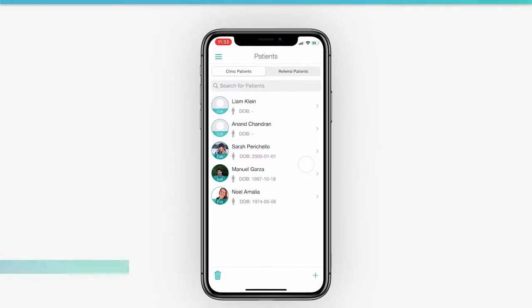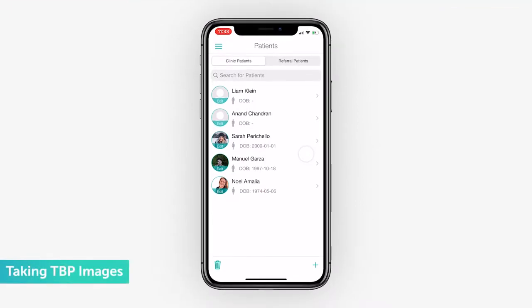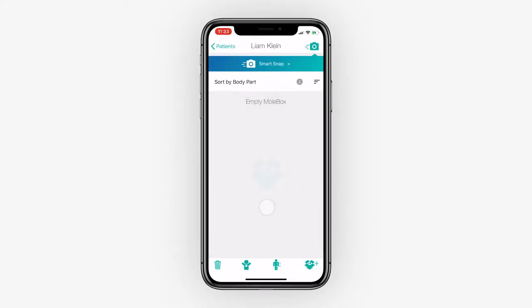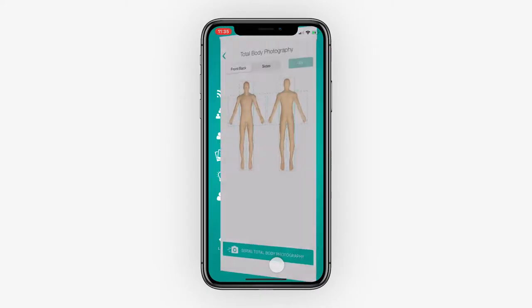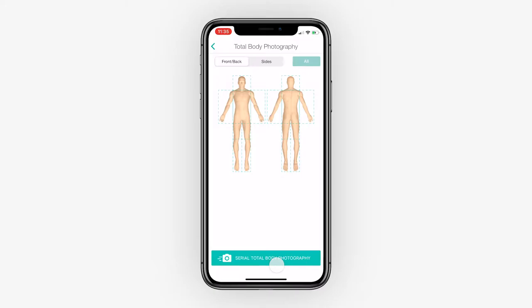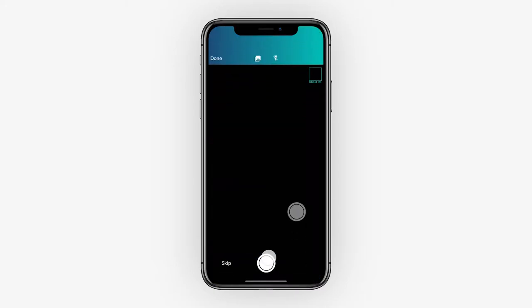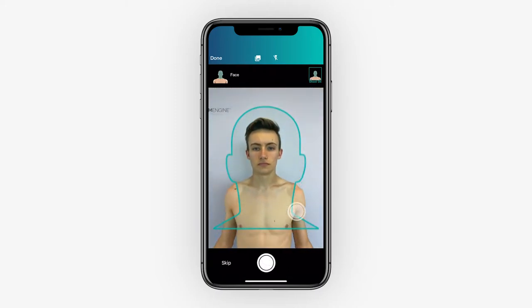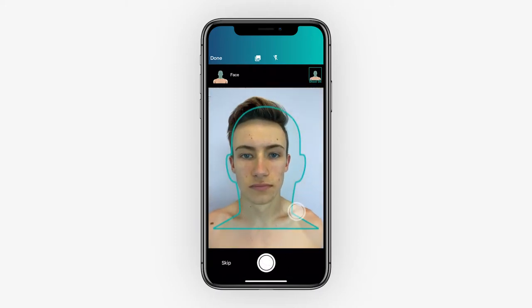To get started, go to your patients list and select the patient you wish to add total body images to, and press the icon at the bottom. Select the Serial Total Body Photography button, and you'll be able to quickly take these images in order of body parts listed, starting with the head.